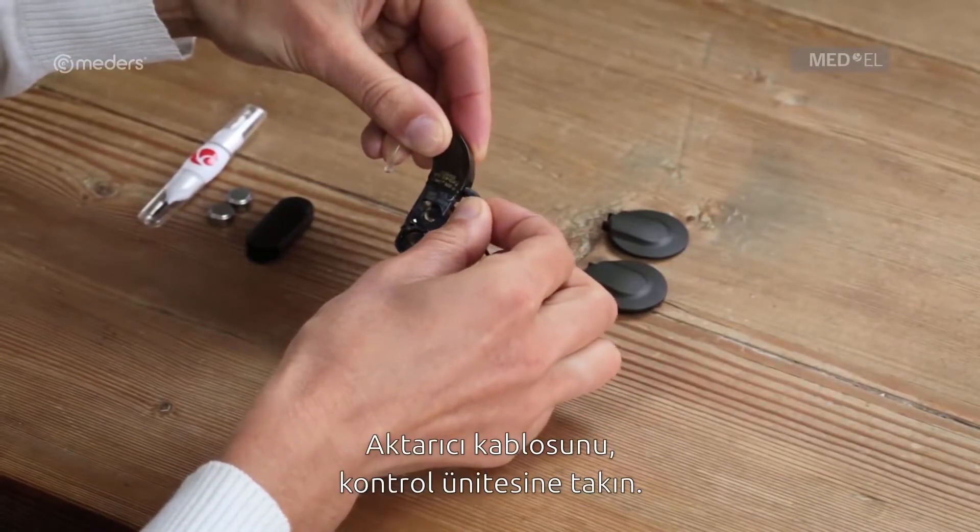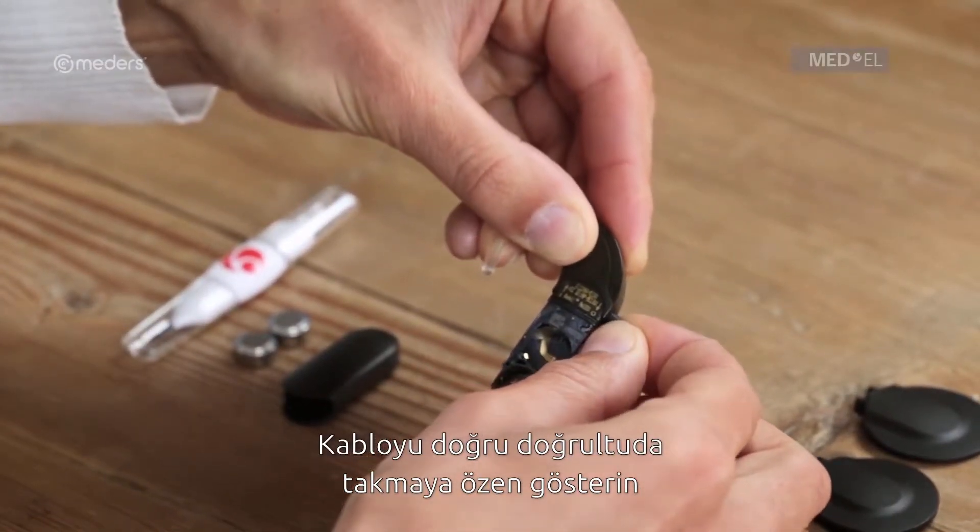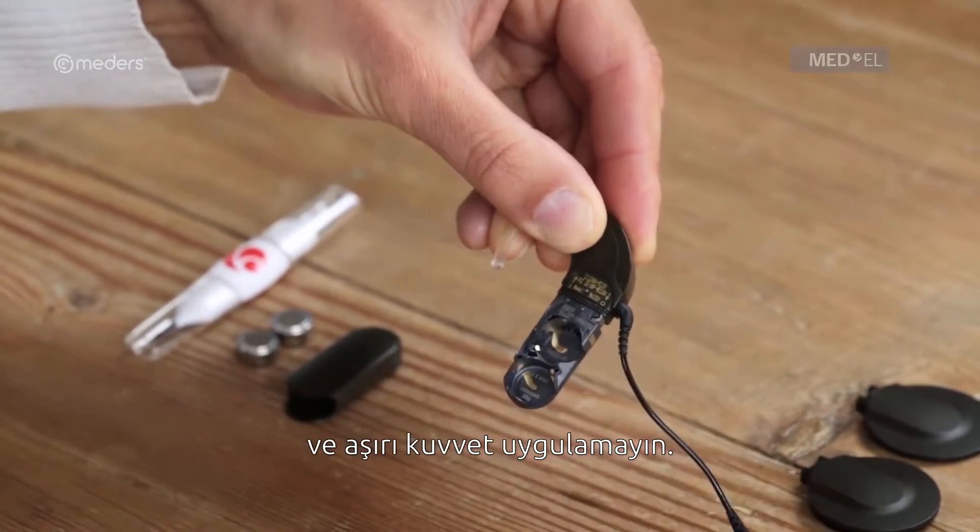Plug the coil cable into the control unit. Note the correct orientation of the coil cable socket and be careful not to use too much force.